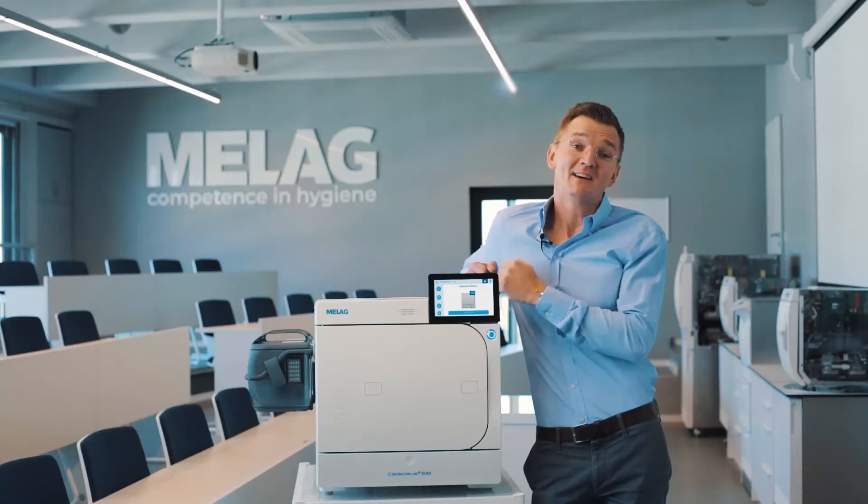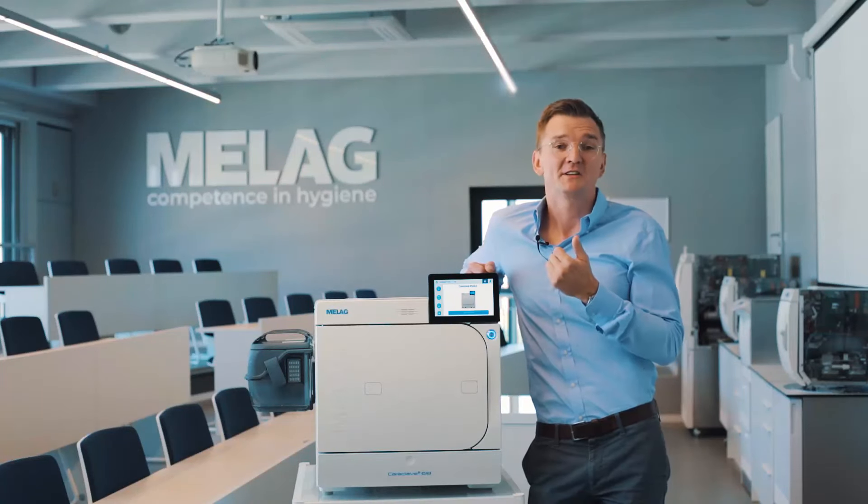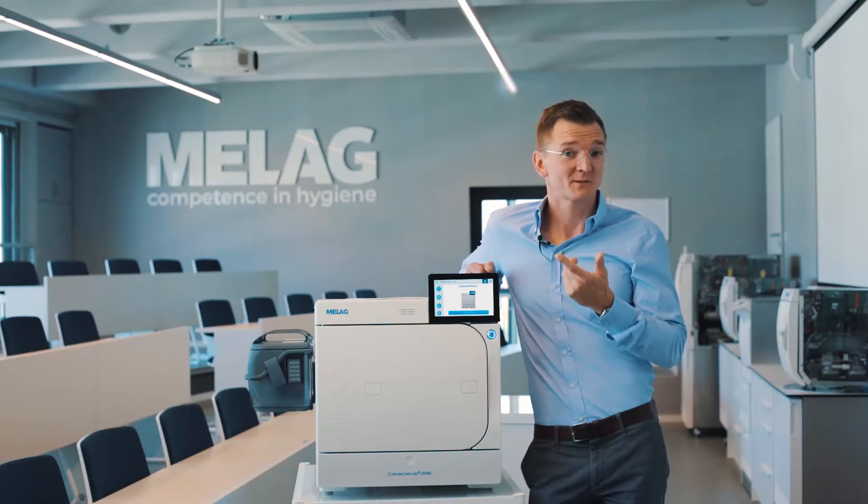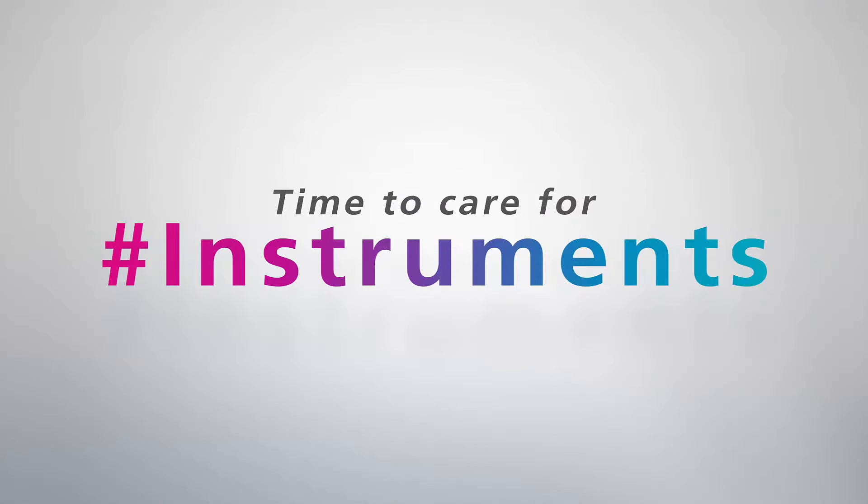CareClave not only offers you the highest protection for your patients but also helps increase the lifespan of your instruments and reduce service costs at the same time.